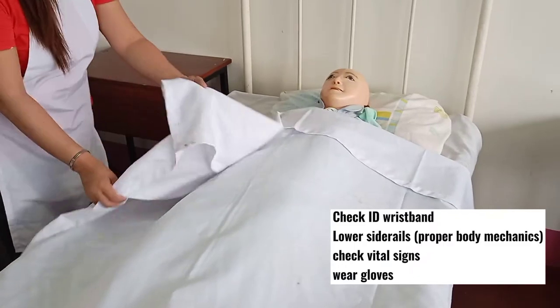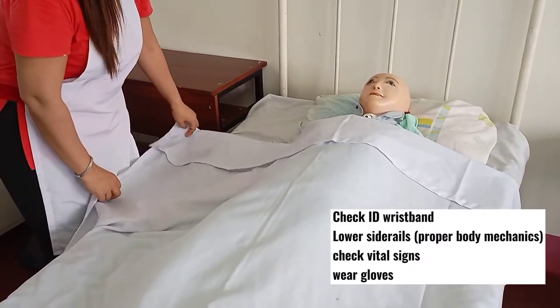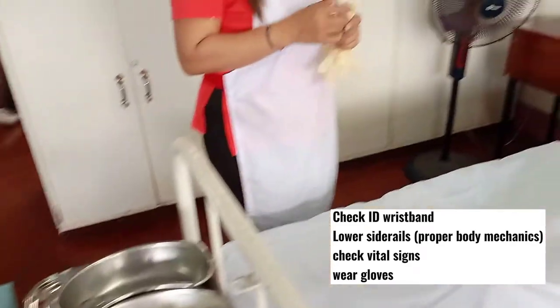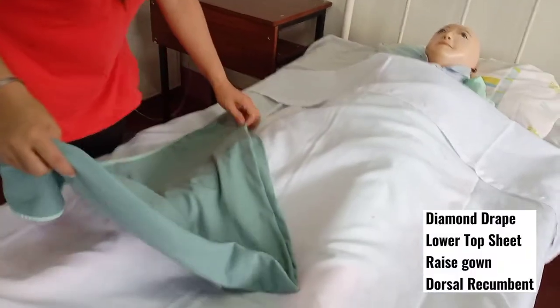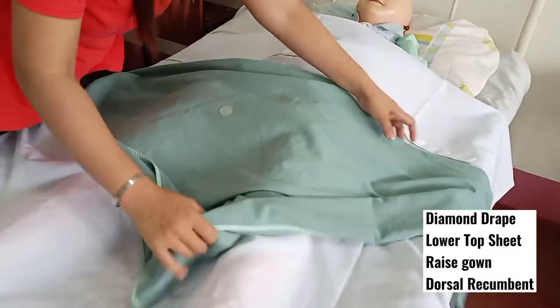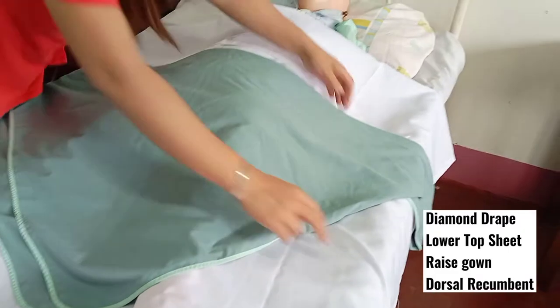Wear the pair of gloves, then get the diamond drape and lower the top sheet.